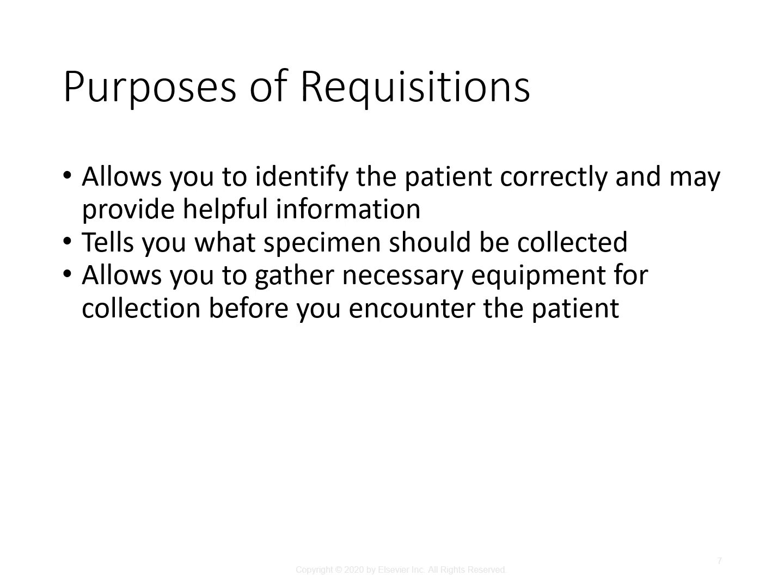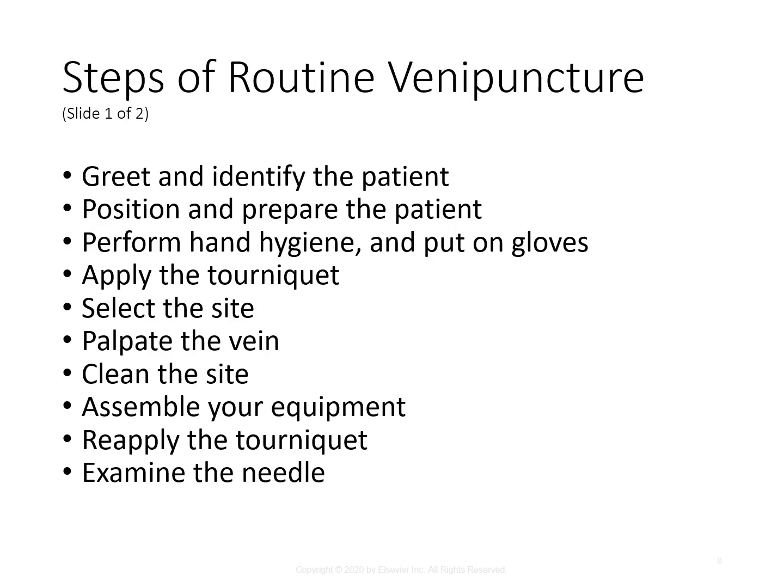So the requisition itself may not indicate the special handling procedures, and you may be required to consult laboratory resources to ensure both correct collection and correct handling of the samples.